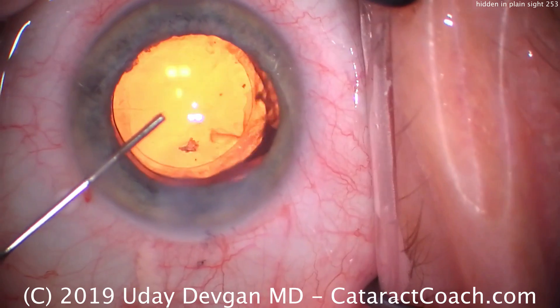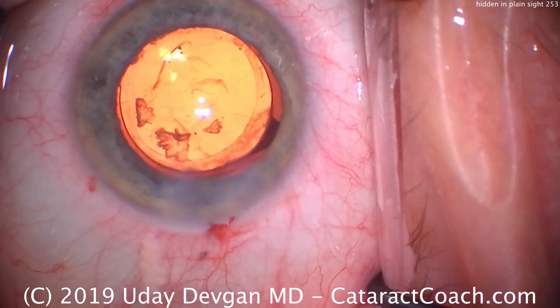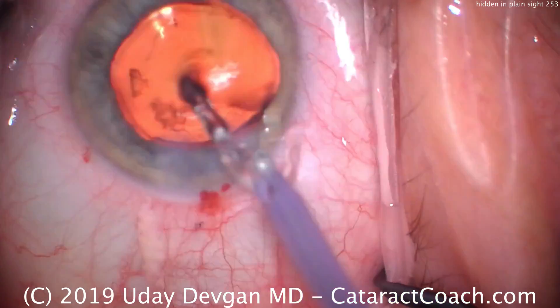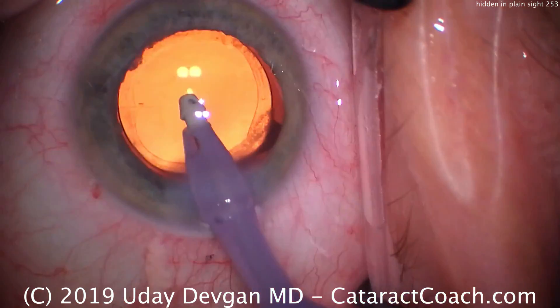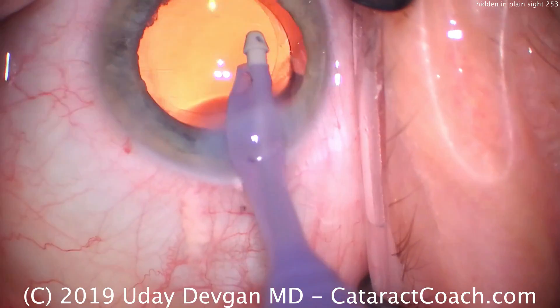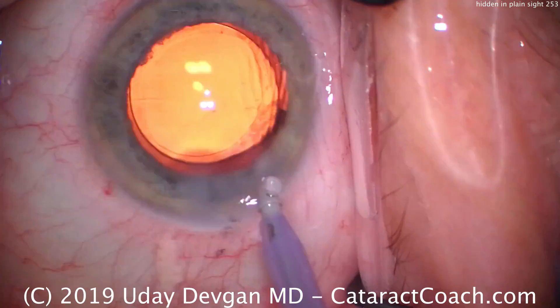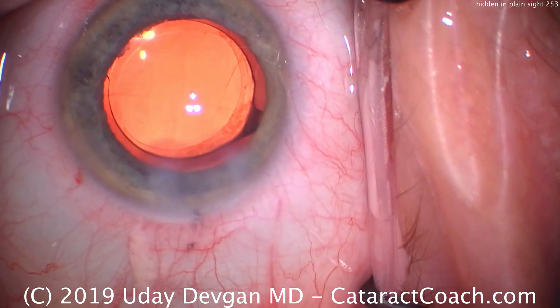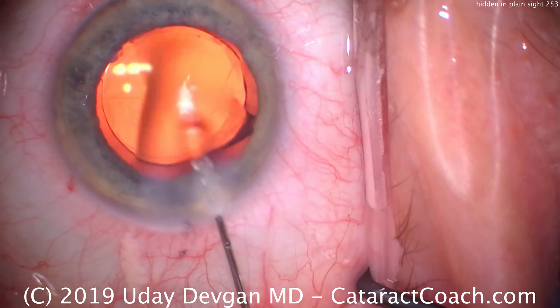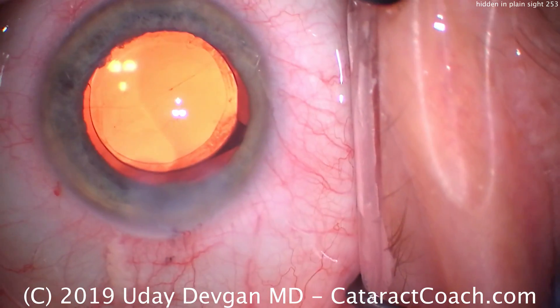Wow — there's a tremendous amount of lens material still left hidden in the angle with that viscoelastic. That's what was hidden in plain sight. If we didn't see that now, we'd have to come back tomorrow or the next day and aspirate that from the eye. So very important: do the angle sweep at the end of the case to make sure there's no retained lens or viscoelastic.